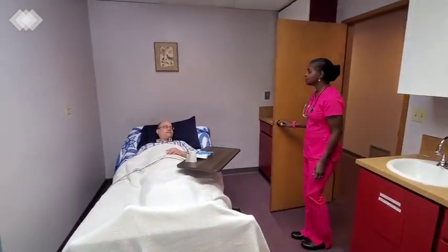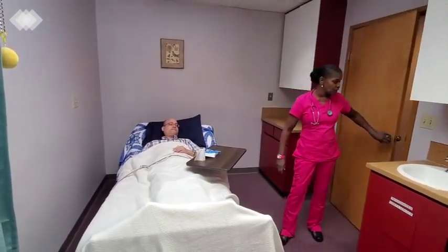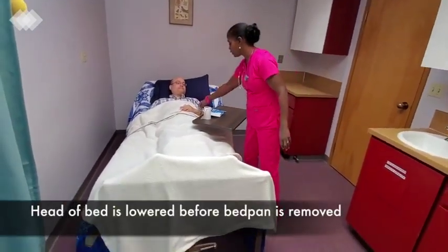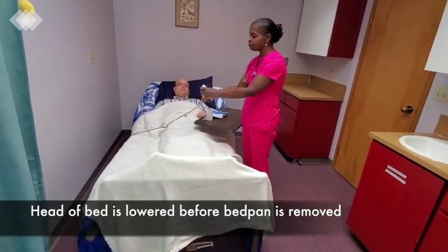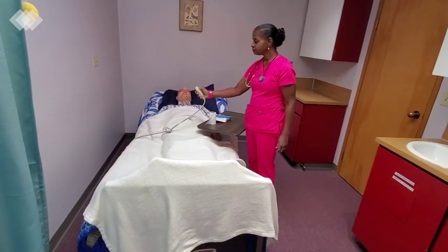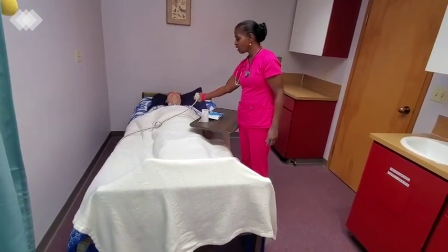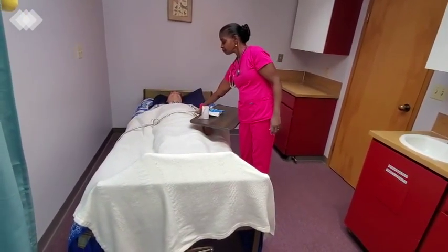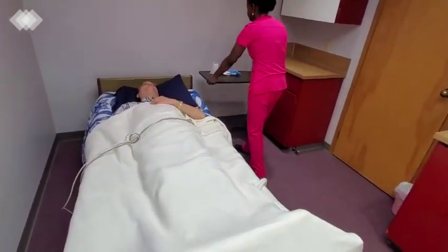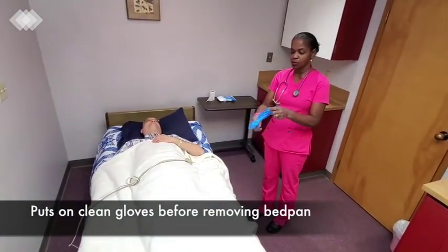Hello, Peter. I see that you have your call light on. Are you done with the bedpan? I am finished. Great. I will close the door for privacy. The bed is still locked and low. Now I'm going to lower your head of bed so that I can take you off of the bedpan — all the way flat. Now it's safe for Peter to lift his hips up, and I can remove the bedpan. But first, I will put on the gloves.